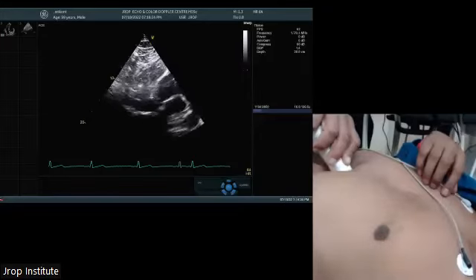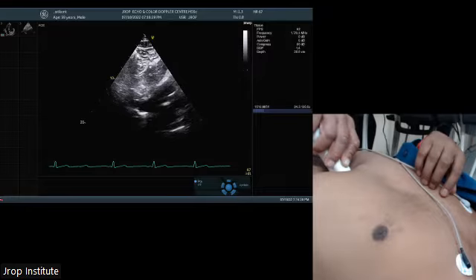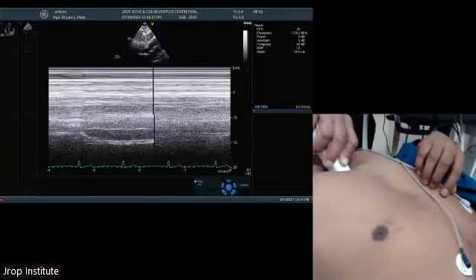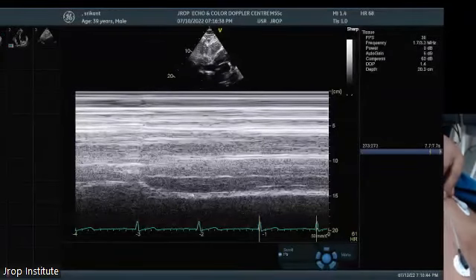You know, I can show you only the collapsed IVC. Yeah, look, sir. IVC is changing with respiration. You could put an M mode on this. Okay, I'm doing an M mode now, so that you'll realize better. Although he was holding respiration, this is the maximum size of the IVC, which changes to this smaller size of IVC.